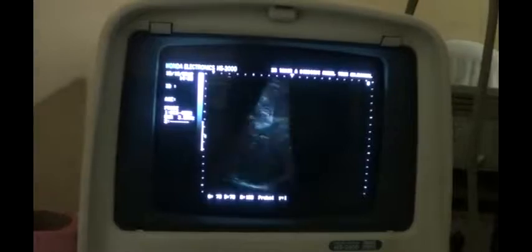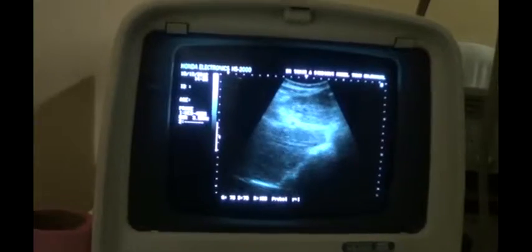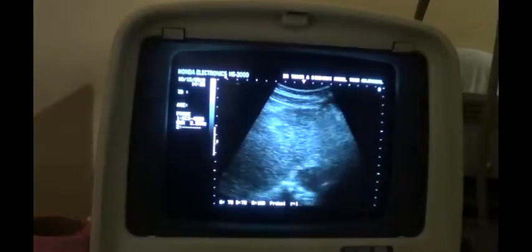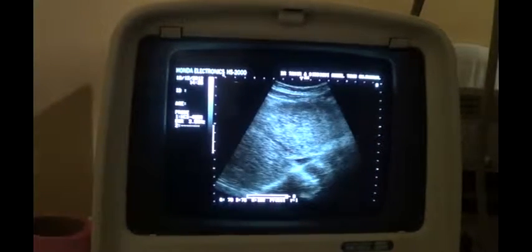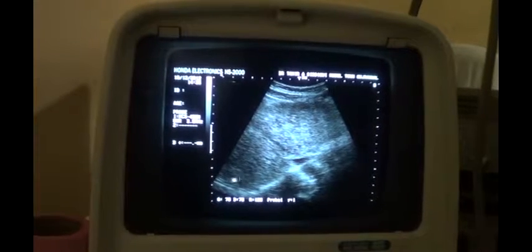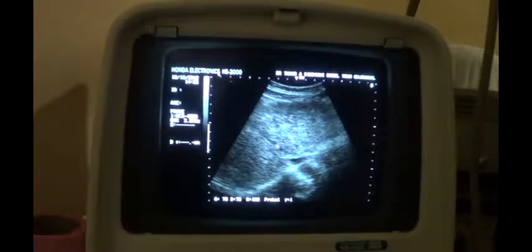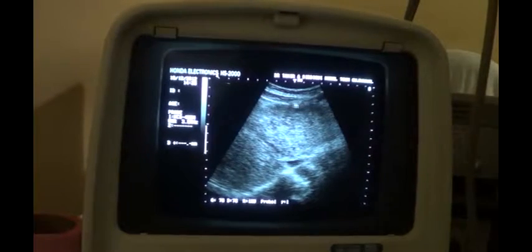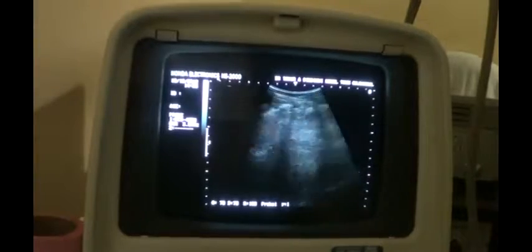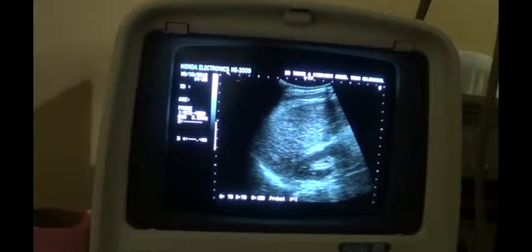This is the study of liver parenchyma, showing you irregular outer surface in this view, with diffuse increased parenchymal echogenicity, coarseness throughout, blurred vessel margins, rather a bit tortuous as well. This is the middle hepatic vein and the irregularity of the outer surface. So this is an advanced stage cirrhotic liver. Note the degree of coarseness throughout the liver parenchyma.